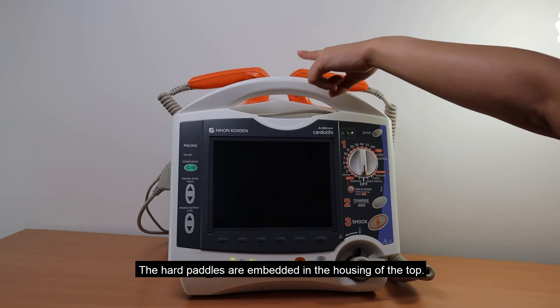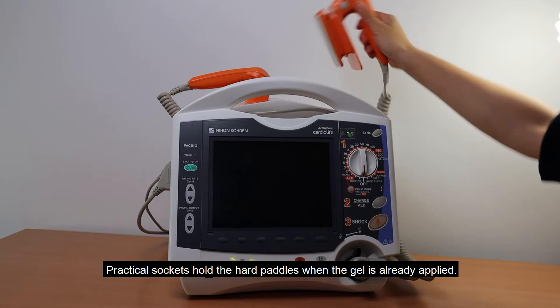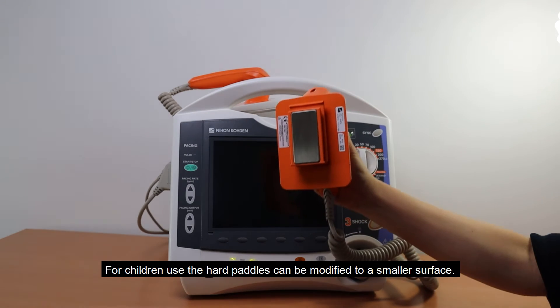The hard paddles are embedded in the housing at the top. Practical sockets hold the hard paddles when the gel is already applied. For children use, the hard paddles can be modified to a smaller surface.